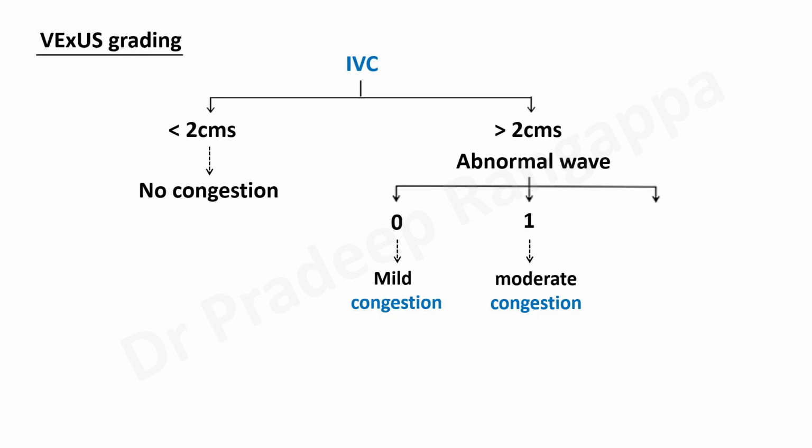If you see S reversal, you don't need to go to portal vein, but for academic reasons, you can look at portal vein to see if there is pulsatility. And if there are two abnormal veins, for example intrarenally you see systolic and diastolic flow, like what Hrishikesh has sent. There are abnormalities in two waveforms, but the hepatic vein was normal in what Hrishikesh sent. But you saw the portal vein had pulsatility and the renal vein had S and D, then it means severe congestion.